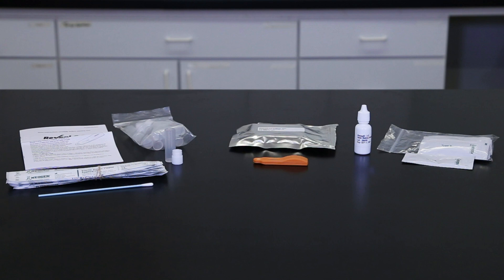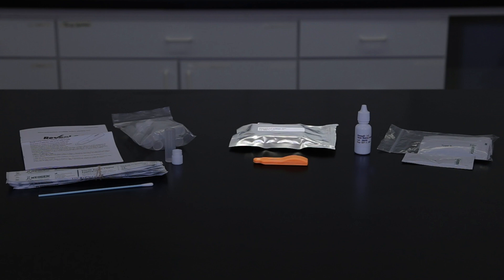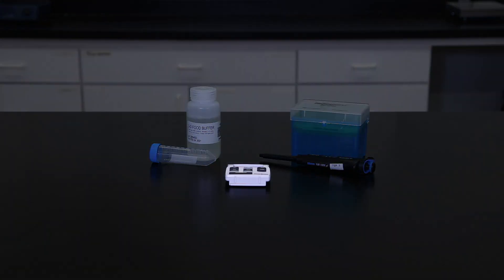The materials provided with Neogen's Reveal 3D for peanut tests include one foil pouch containing 10 Reveal 3D for peanut devices, 10 sachets containing extraction buffer, 10 sample tubes and caps, 10 individually packaged sterile swabs with break-off tips, one bottle of swab wetting solution, and written test instructions. Additionally, a timer is necessary. A 1,000-microliter pipetter is recommended for liquid sample measurement. Other Reveal 3D tests may require a 250-microliter pipetter for sampling.